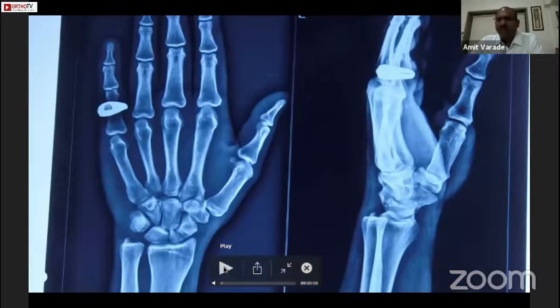This patient presented eight days after the injury and had a fracture at the junction of the waist and proximal pole of the scaphoid.